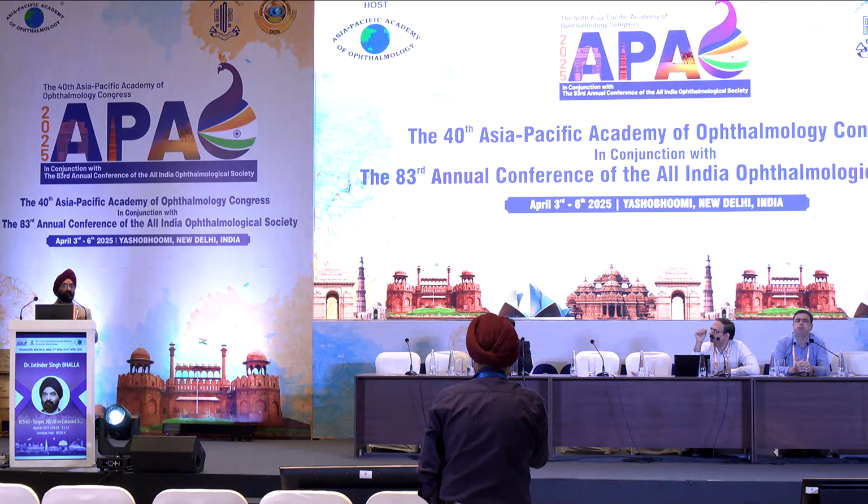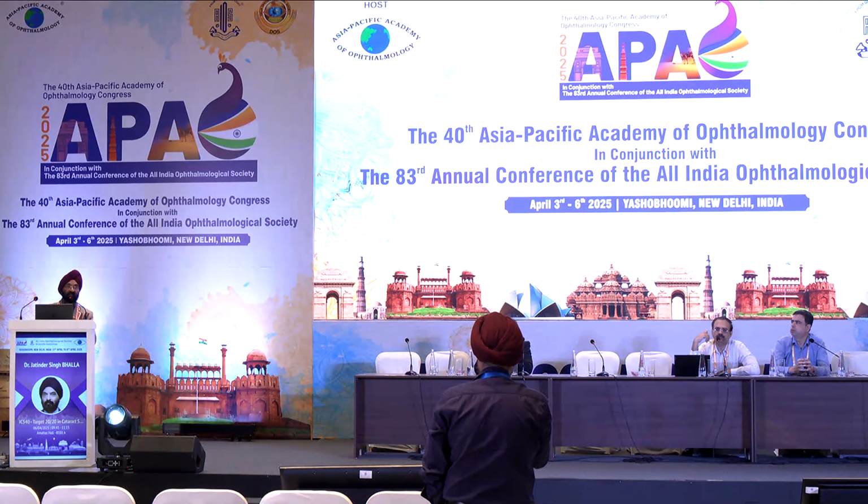I think here we also have to be aware that the ocular surface disease has to be optimized. A lot of these patients where you get different keratometry readings even on repeated examination, please don't do IOL power calculation on the same day. Put this patient on good lubricants so that the ocular surface is nicely optimized, and then do keratometry maybe after a week to 10 days. You will be surprised, you get different keratometry readings after you have treated their ocular surface disease. So that is what I follow, because if you keep on getting different readings on the same day, don't take that reading. Treat this patient for ocular surface disease.